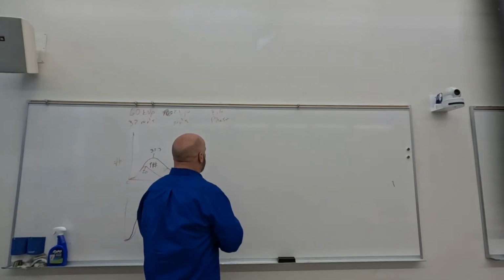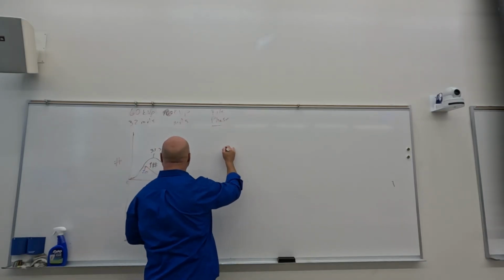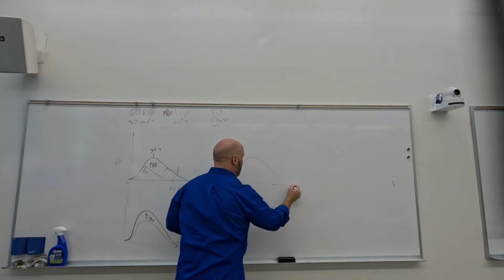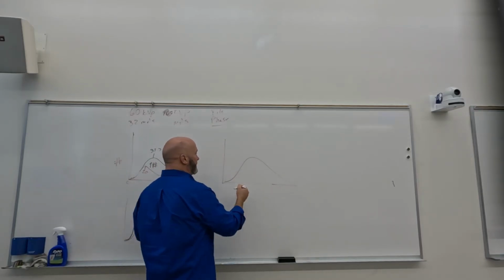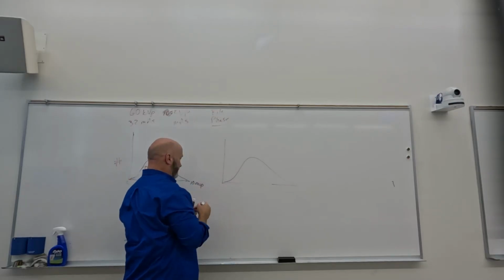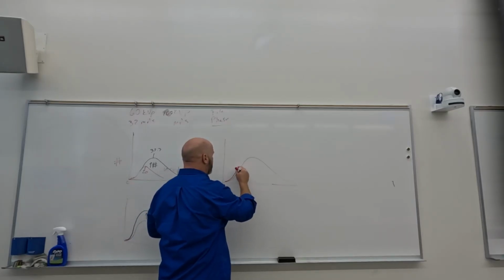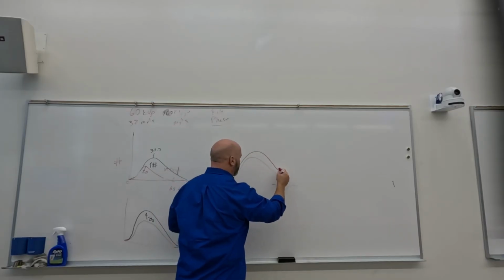So let's go with machine phase. Let's do that first. With machine phase, again, we have the same technique on both of these. Both of them are going to be 60 kVp at 32 mAs, okay? So with machine phase, we get an increase in numbers by a factor of 2 if we go from single phase to 3 phase.